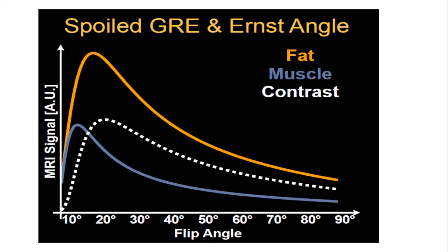So it's a great deal of work. Of course, the manufacturers have already done that for us, but at times it's also good for us to check things out ourselves. So if you want to have the maximum signal between the two tissues, we should apply a flip angle of about 20 degrees, so that we have this maximum amount.